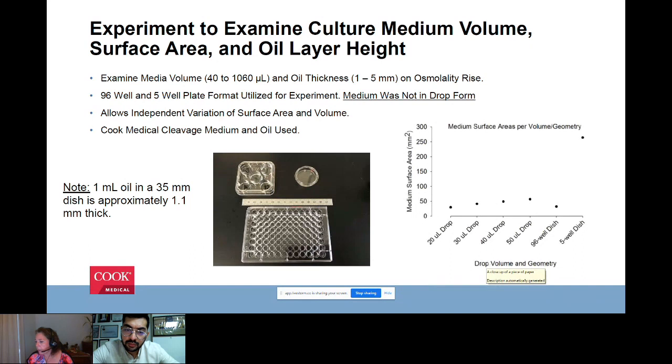but it is the fact that you're going to use a dry environment that's going to cause an issue. But using it at 37 degrees, if you're in a humid environment, all of the media manufacturers have actually checked how long the oil can be in an incubator. The difference is if they have looked at a dry or a humid incubator. It depends on the company, because as I was saying at the start, every company has got their own incubator.